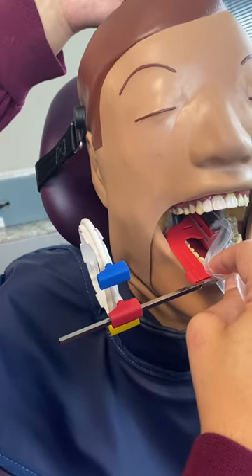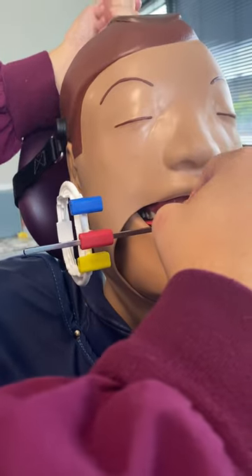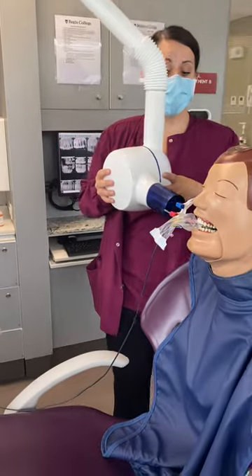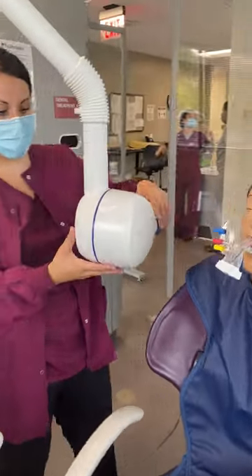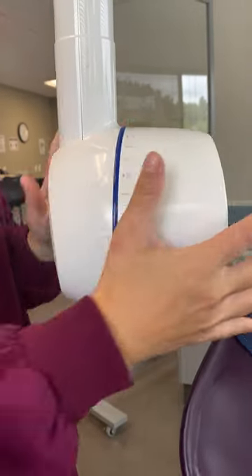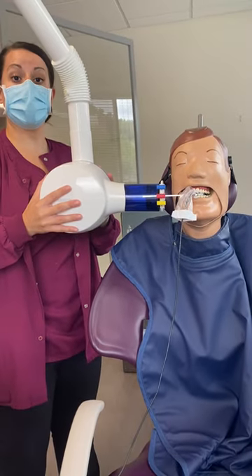Our key into proximal space is between our first molar and our second molar. Once I have everything lined up, I'm going to slowly have Dexter close down. Always make sure your PID is close by to you. Our angulation is going to be positive 10 degrees — remember, positive angulation is downward. So we're going to line up positive 10 degrees, and that's going to be our molar shot.